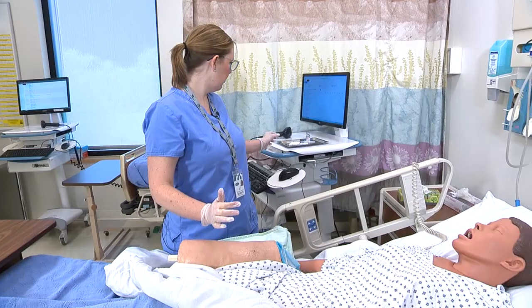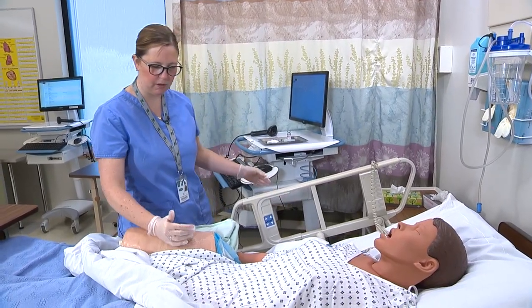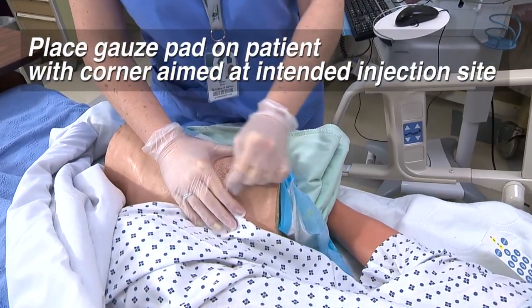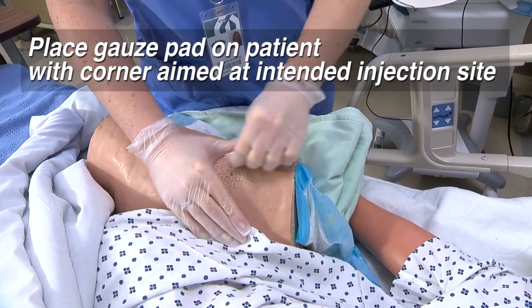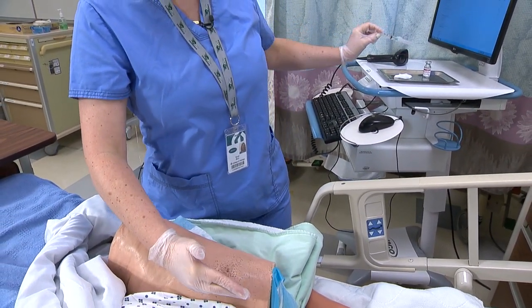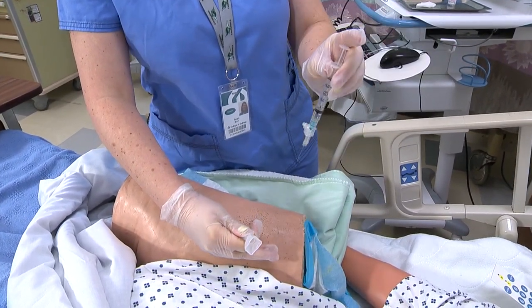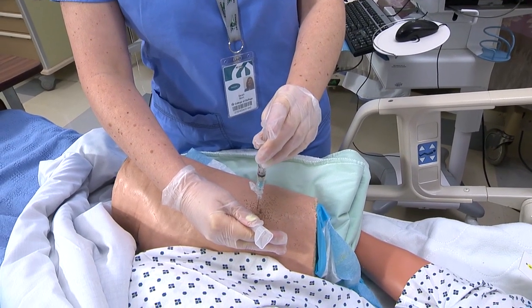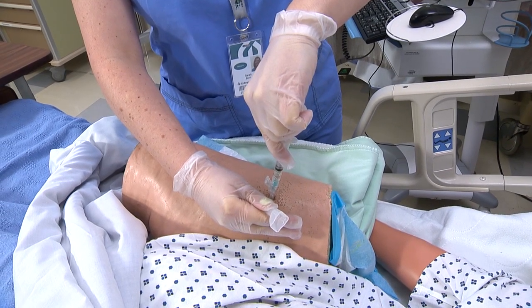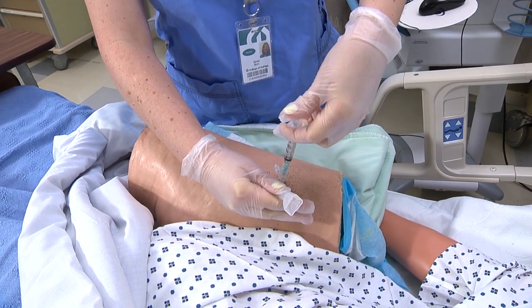Morgan, I have you turn on your right side. I'm going to clean the area — it might be a little cold. I'm placing my palm on the greater trochanter with my fingers at the iliac crest, and cleaning my area. Then I'm going to Z-track. Remember, I'm left-handed so I inject with my left hand. You want to inject at a 90-degree angle. Aspirate for five seconds and make sure you get no blood return — if you do get blood return, you need to stop. I have no blood return, so I'm going to inject the medication.